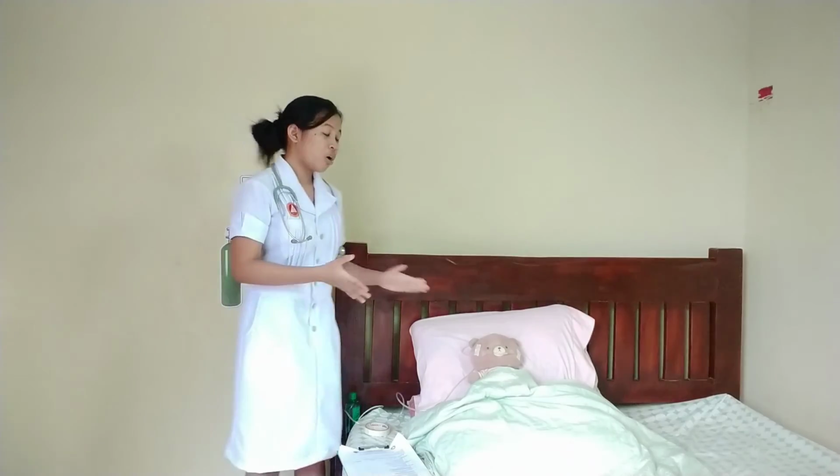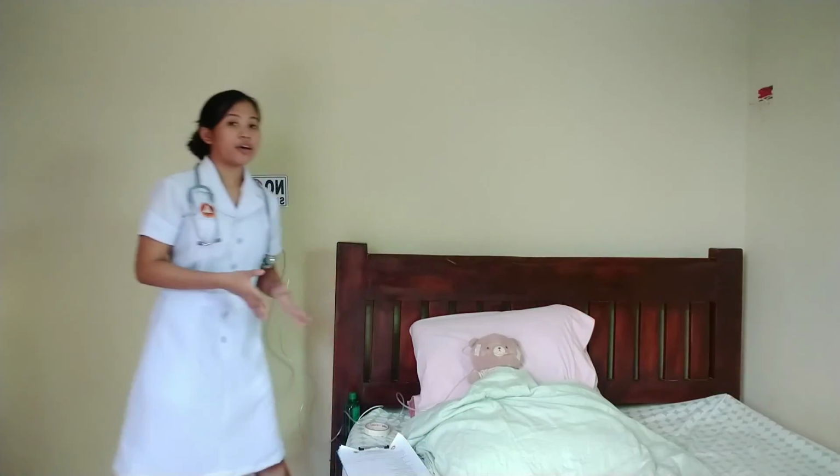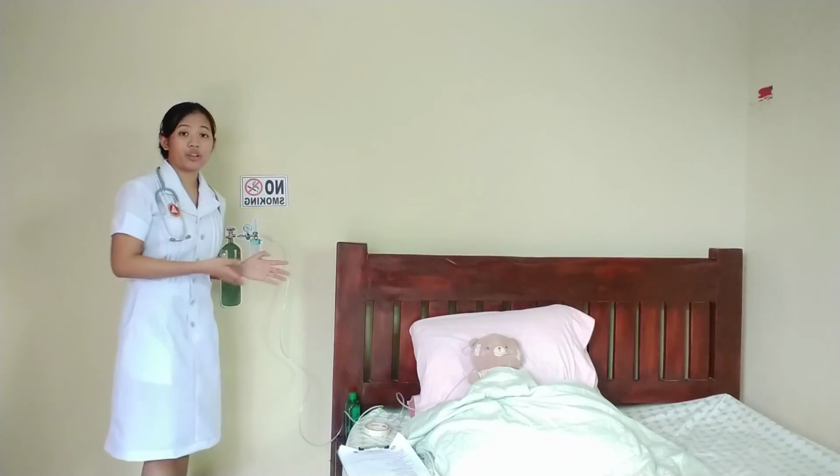Also, we should check the equipment on a regular basis.